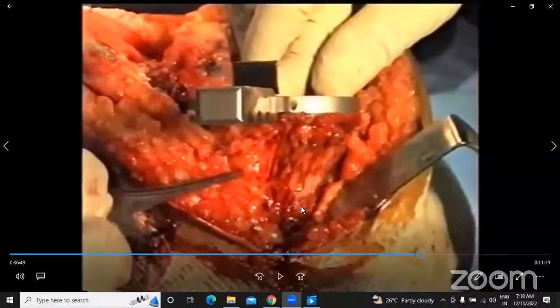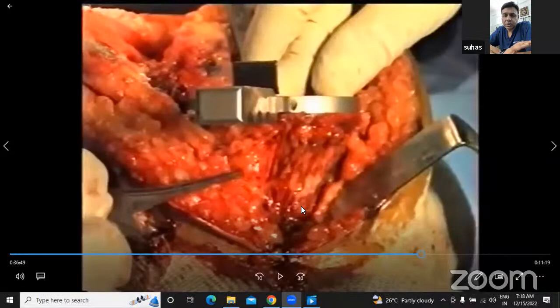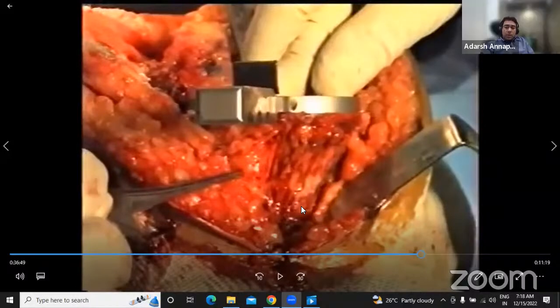If you've already prepared a particular size on your femoral side, you should always have that in your mind. So the first thing you should do is, after you take your tibial cut, size it right away. Then you know the size of your tibia, and you also know how much bone you have, more or less, right? Then when you're doing the femur, you make sure you're using a compatible femur on the femoral side. You can play around a little bit over there.